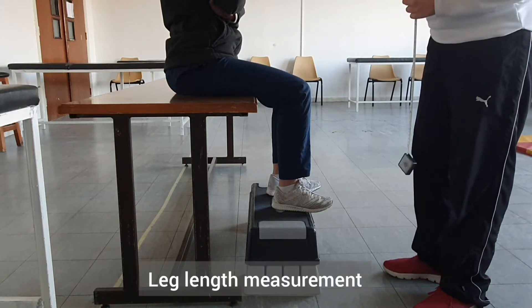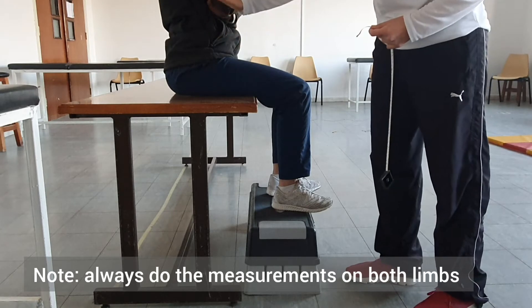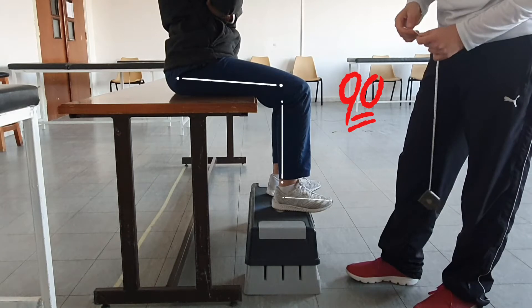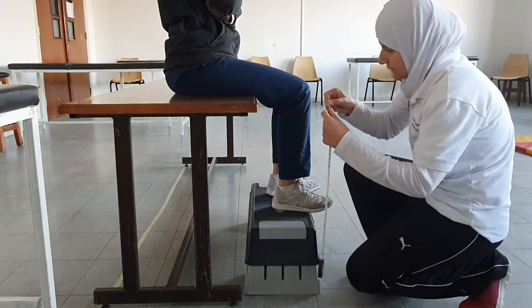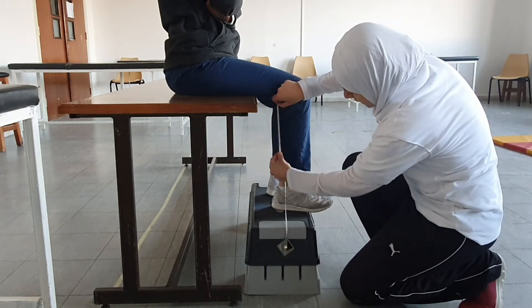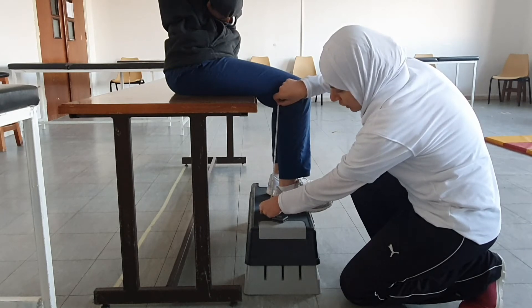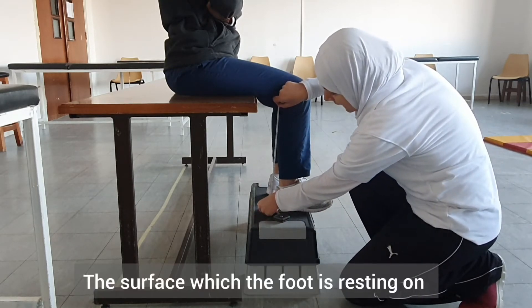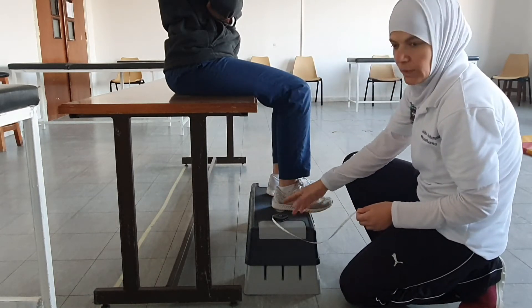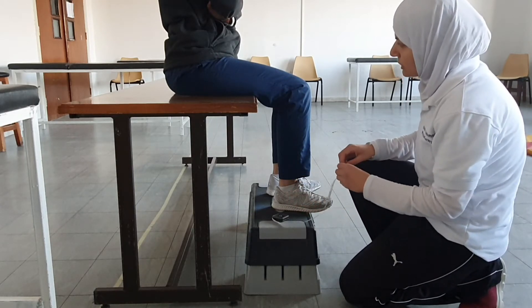We will do the leg length measurement. For this one, we will have the patient sitting upright on a hard surface with the hip, knee, and ankle bent at 90 degrees. For the leg length, we will measure the distance from the back of the knee — this will be our starting point — to the surface, whether that's the floor or a step. This will be the leg length. Usually we do this with the patient wearing footwear, because that's how they would be in their chair.